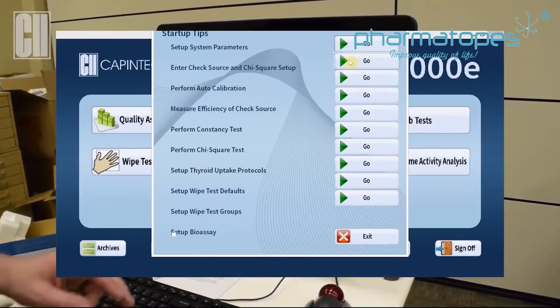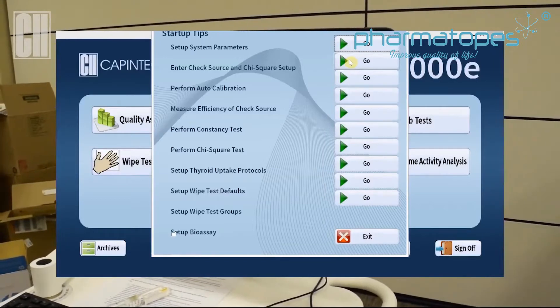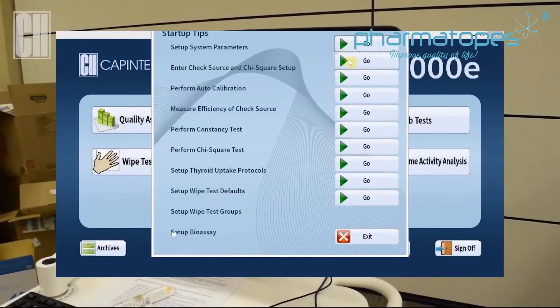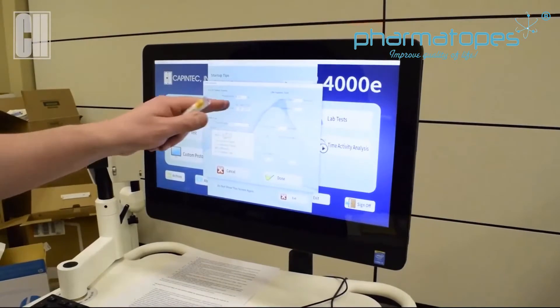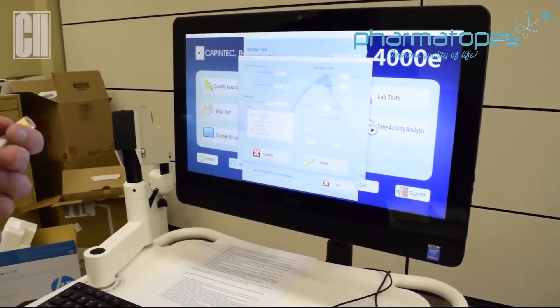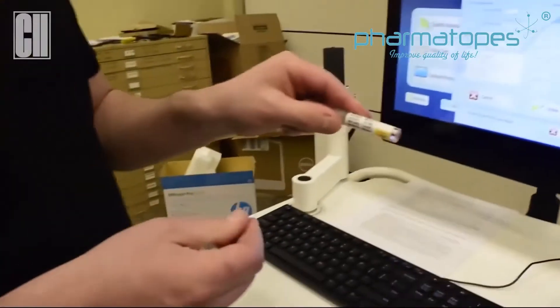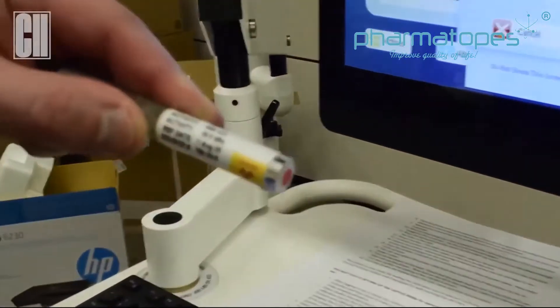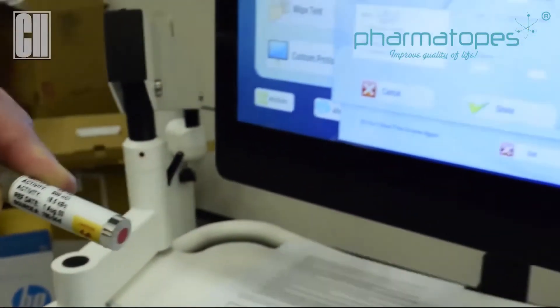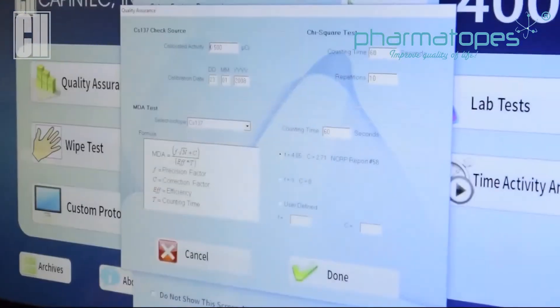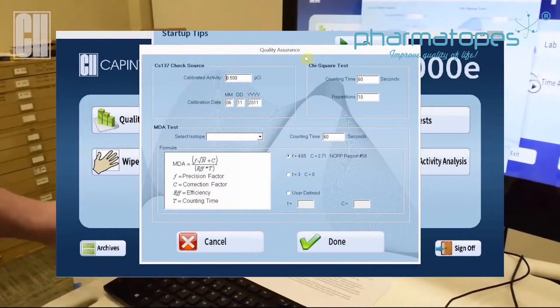The next step is to enter the check source in Chi-Square Setup. At this point, we want to make sure that this information for cesium matches the information that's on our test source. We're going to match that information.